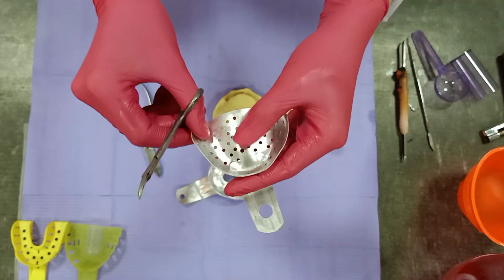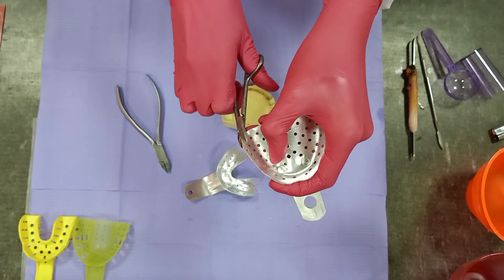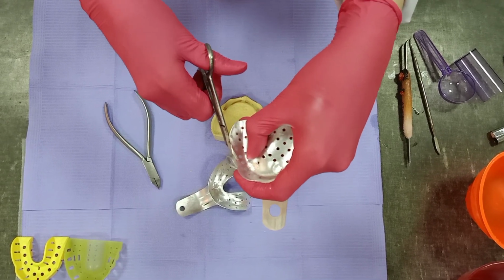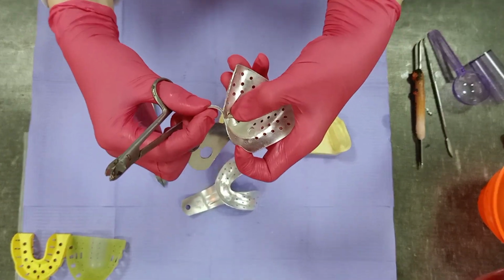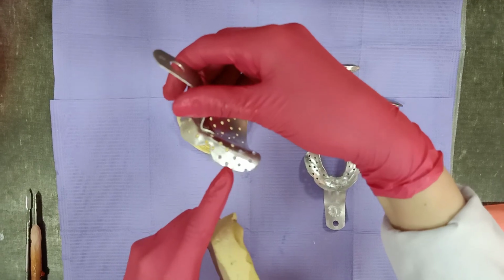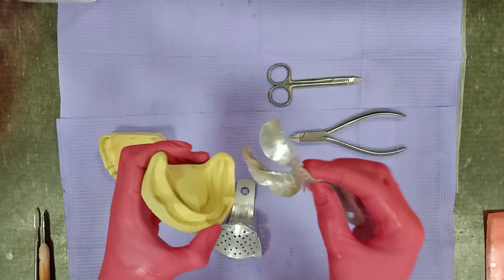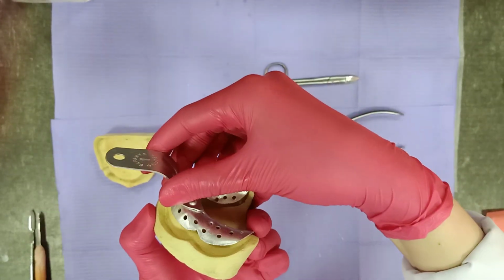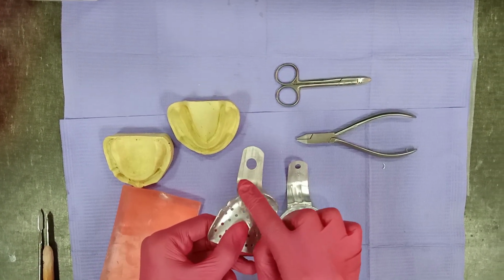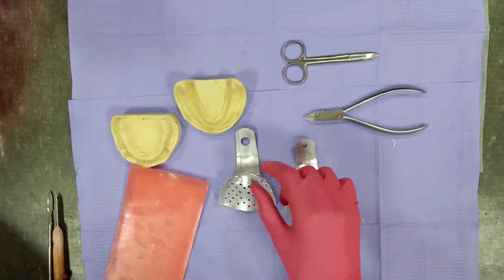After that, we are going to cut the borders of the tray if needed according to the sulcus in the patient's mouth. After cutting all the borders and opening all the frenal area, now we are going to check the tray on the cast, the upper and the lower, and then we have another step, which is protecting the borders of the tray to avoid any injury in the patient's mouth.